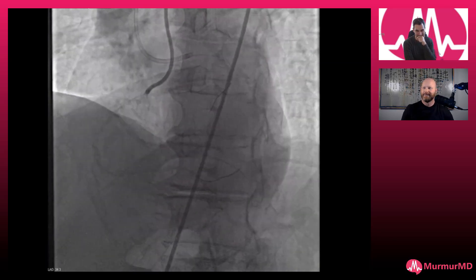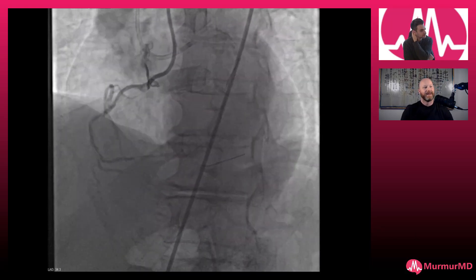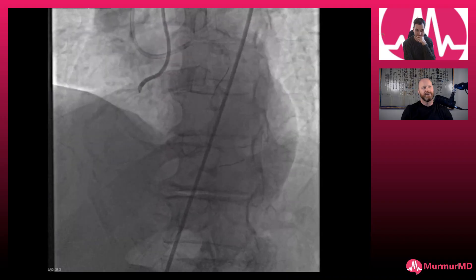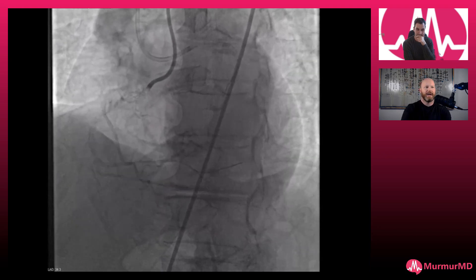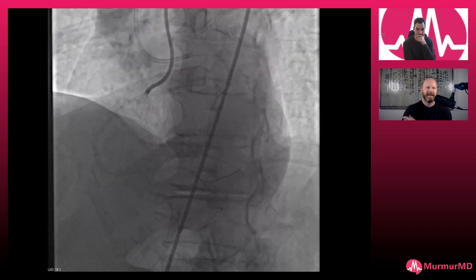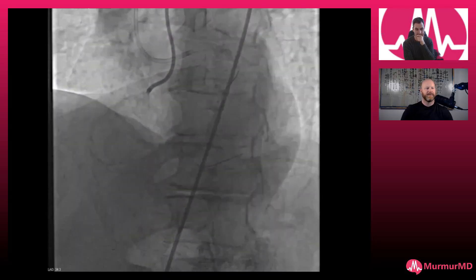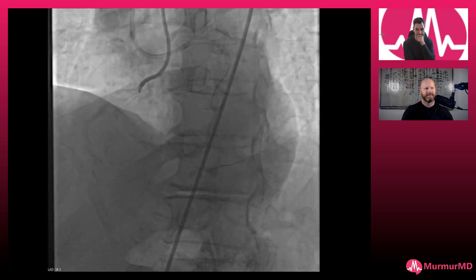That could have been on the way out, you know — oh, we forgot to tell anybody that we did this. But here's the flow after a pretty good, pretty big channel. The interesting thing is the Rotoblader didn't get hugely hung up. I burred this at pretty high speed — I think I started at 185 and when I got down toward that final corner where the microcatheter hung up, I just had them turn it to 200. I didn't want to get stuck and trapped or deal with any of that nonsense. I burred at pretty high speed to try and not get the thing stuck.